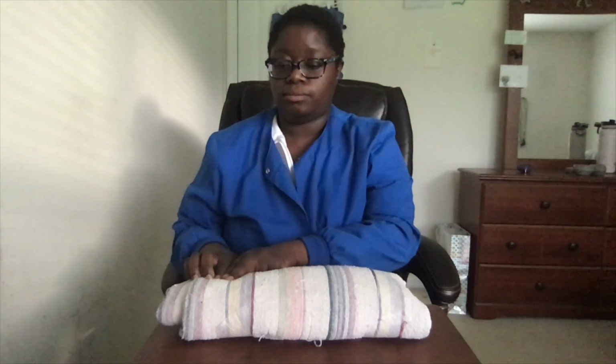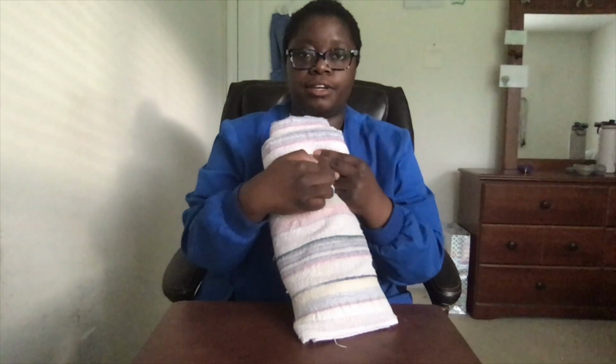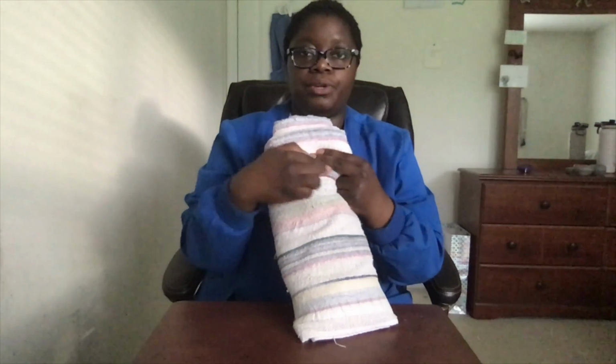The first thing I'm going to show you are the three common areas to give an intramuscular injection, as demonstrated on this towel. The first being the deltoid. To find the deltoid, go to the patient's acromion process and place 2 fingers underneath. The triangular area below my fingers is the deltoid and where you can give the injection.